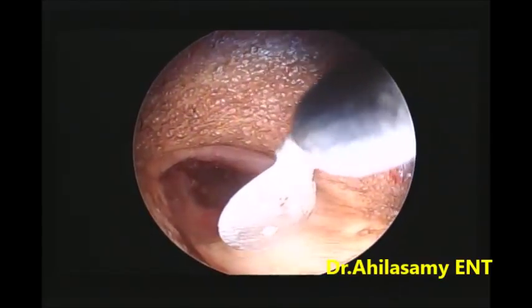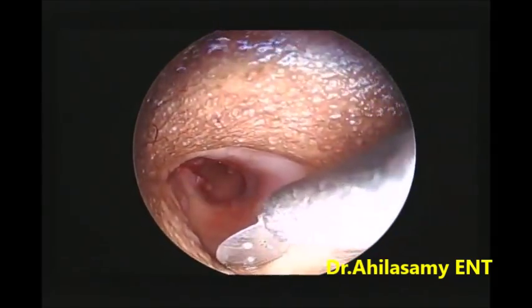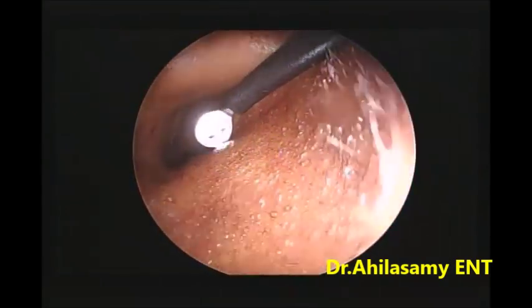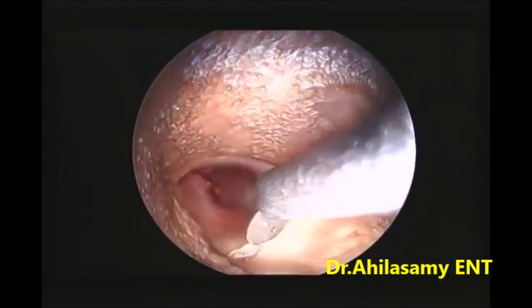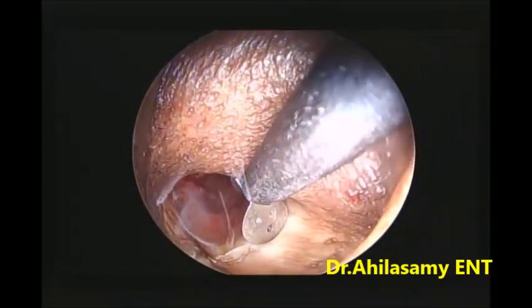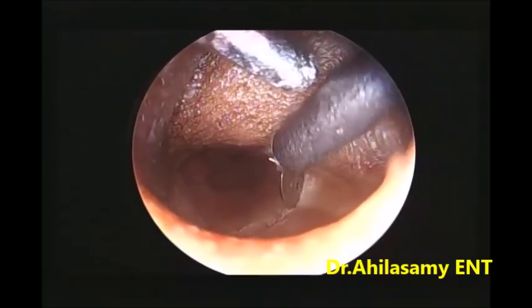You can make the incision with this using the monopolar and then elevate with the same knife. There will be fumes, but ask your assisting nurse to suction the fumes with the suction tip, then you will have good vision.